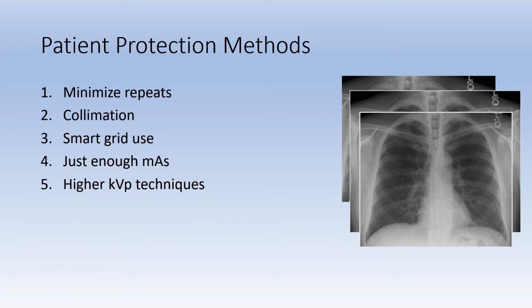The use of higher kV and lower MAS techniques benefit patient dose to a point. Contrast is not adversely affected by kVp like it was in the film screen era. The 15% rule still works and can be used to swap MAS for kV.